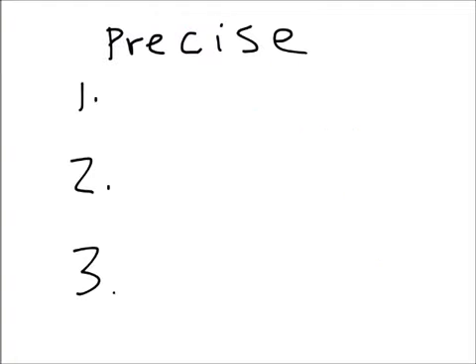Now, how do I obtain a plateau pressure? How do I get this measurement? On some newer ventilators, you might see this measured value displayed all the time. However, it could be incorrect. To get a precise plateau measurement, I need to do one of two things. I could set an inspiratory pause in volume control ventilation, or I can perform an inspiratory hold maneuver.